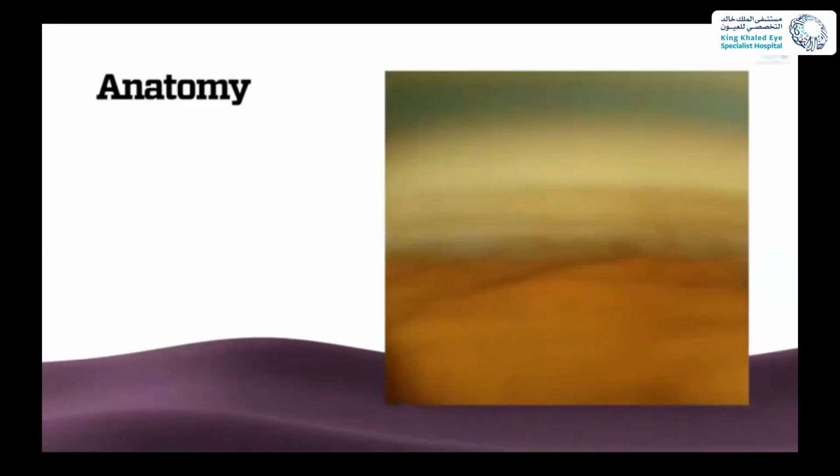What you are trying to find is the corneal wedge. And that is the outermost peripheral point of the cornea. And that's the point at which the cornea is turning into sclera, and that is Schwalbe's line. And the reason that's important is that Schwalbe's line is the anterior most extent of trabecular meshwork. That is the sort of picture that you get. It's blurred, it's not obvious to start with.